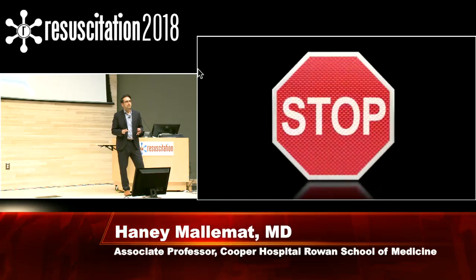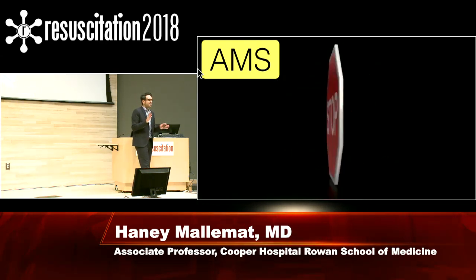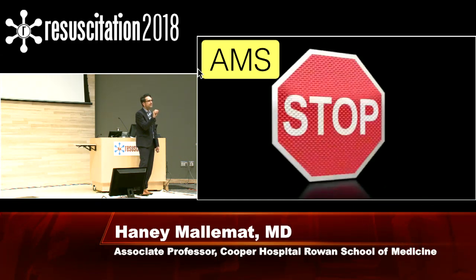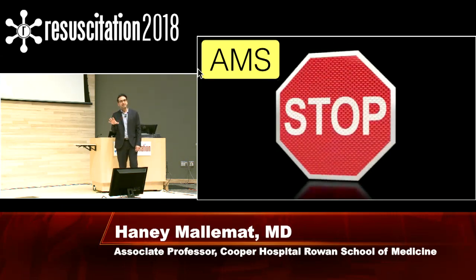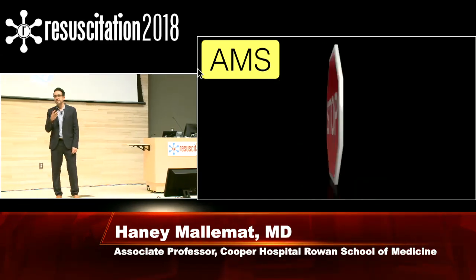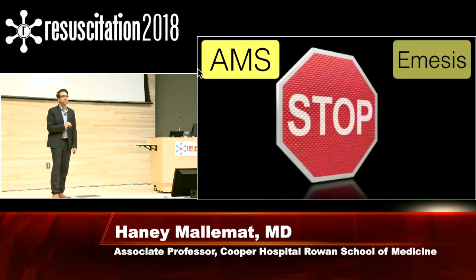Now, just a quick review. Patients that we don't wanna do non-invasive on are patients who are completely altered. Now, it's kind of like the art of medicine, what you call alteration. You've all had those people come in who are a little confused, but with a little bit of non-invasive, maybe they'll turn around. That's fine, because hopefully you're standing by their bedside ready to help them. But the person who's truly altered can't clear the secretions. They can't clear their aspirations when they vomit. They can't tell you, doc, enough is enough. So if you're not staying by the bedside, be very careful with the person who's truly altered.